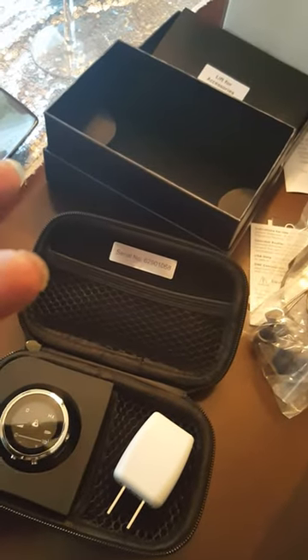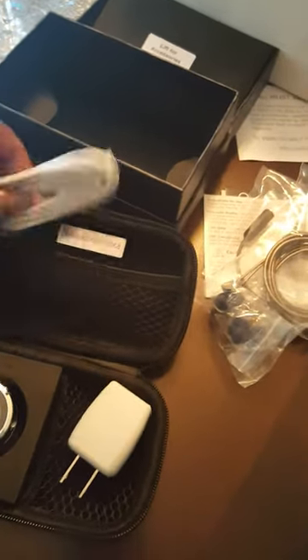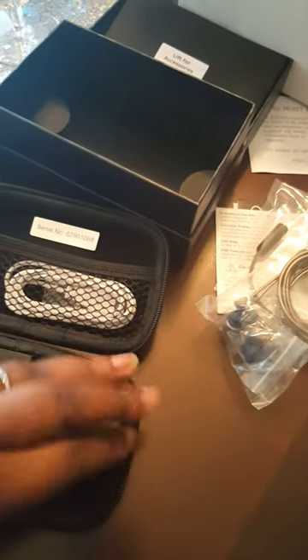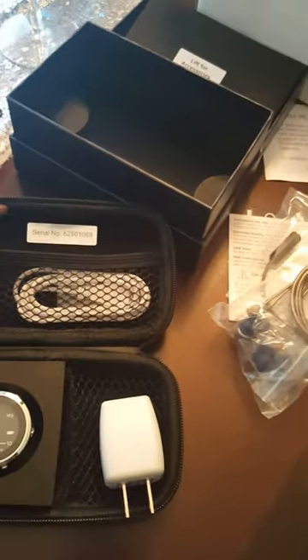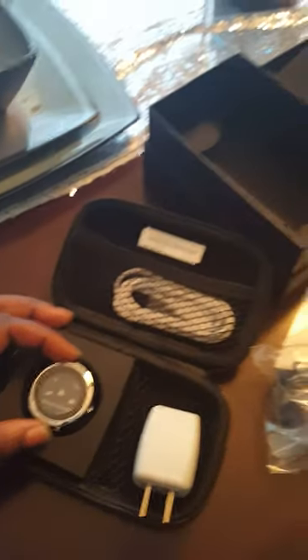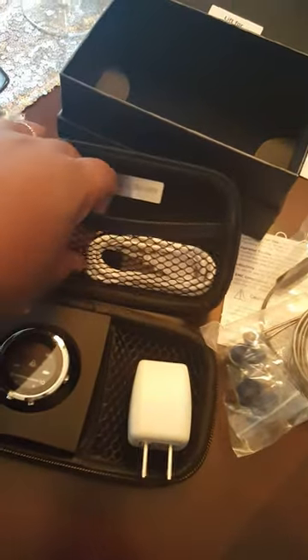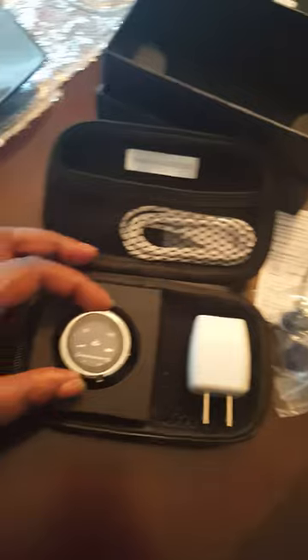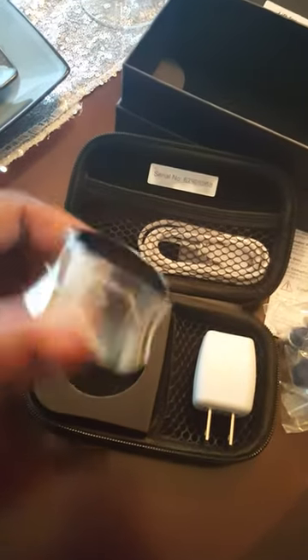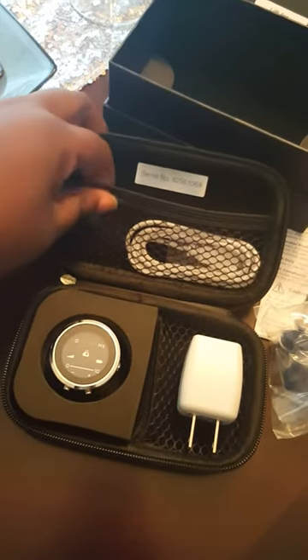That looks like a USB charger maybe — oh, it goes to the charger. My biggest concern would be scratching this up. I'm really OCD when it comes to scratches. It looks like it's going to protect it pretty well. I mean, for it to cost over $500, I think that surely this won't scratch it up.